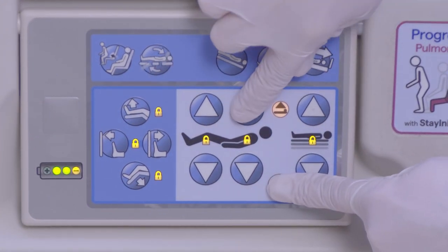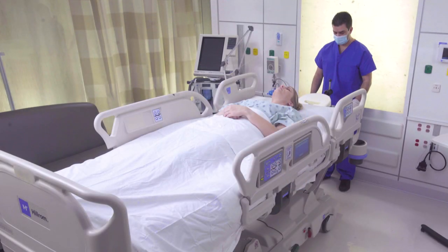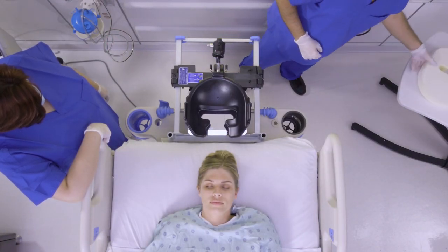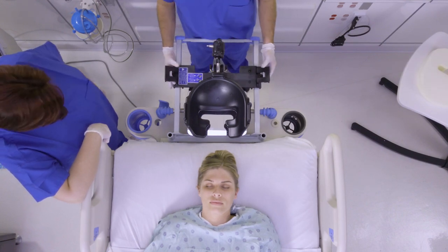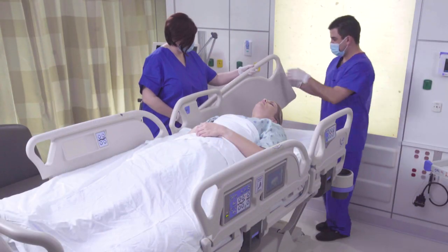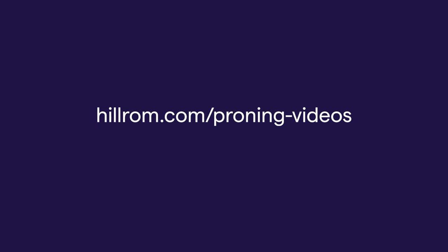Activation of the manual lockout functions is recommended. Once your patient has been placed back in the supine position, the accessory can be disconnected as one unit by pulling up on the bracket or removed by component. Press down on the white clamp locks to release the slide clamps. Ensure both latches have been released and lift up to remove the head positioner. Remove the bracket and replace all parts or accessories previously removed during installation. It is recommended that you read the full instructions for use of the ICU proning accessory. For more information, visit hillrom.com/proning-videos or contact your local Hillrom representative.